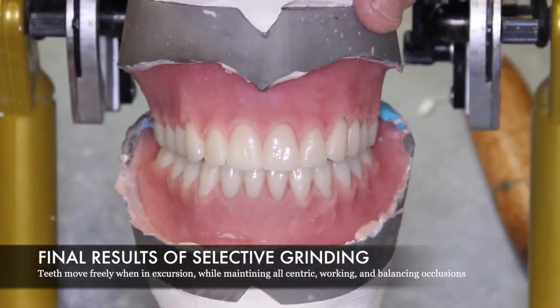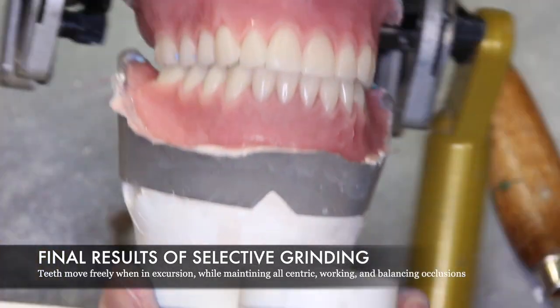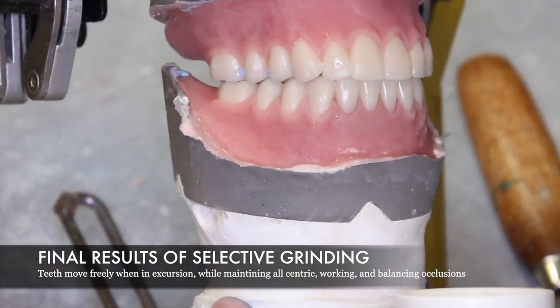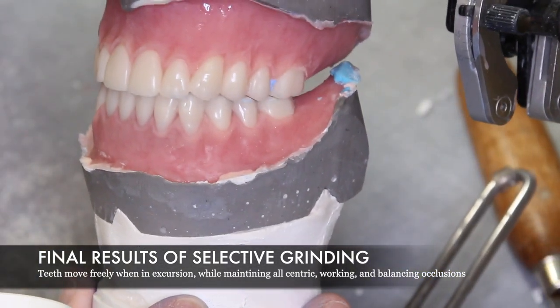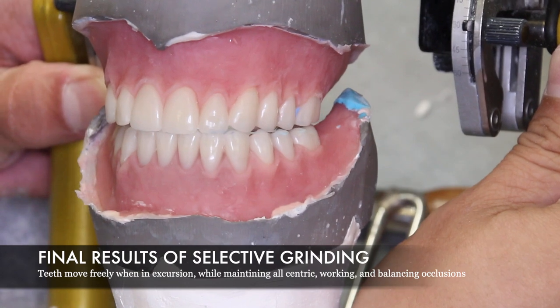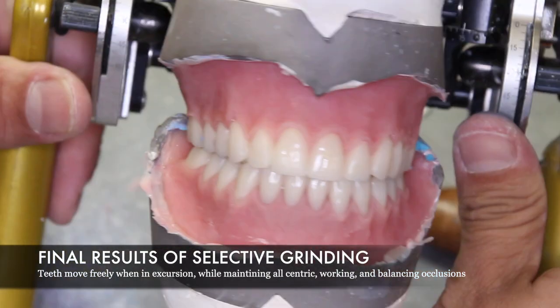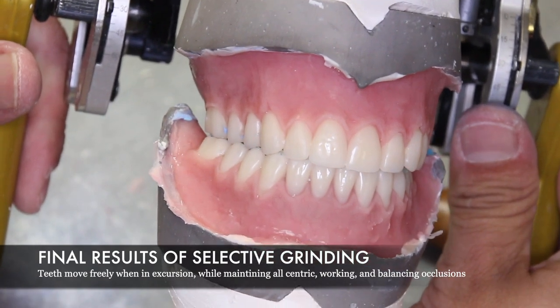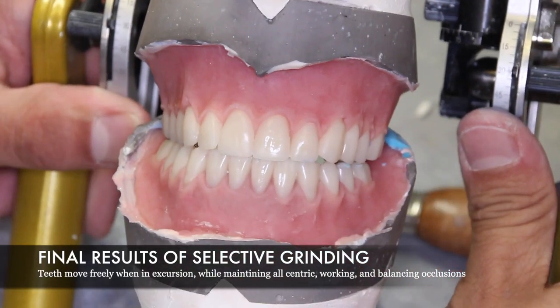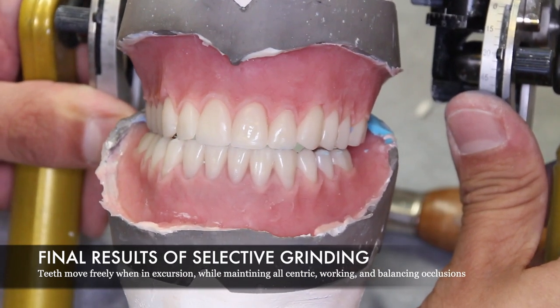Upon completion of selective grinding, the results will show a proper centric occlusion, a restored occlusal vertical dimension, proper working side contacts and balancing side contacts, along with protrusive contacts. All these things will result in a faster appointment time and minimal adjustments during final insertion.